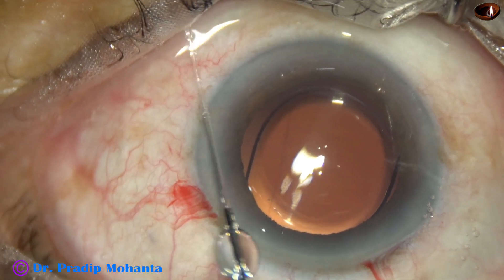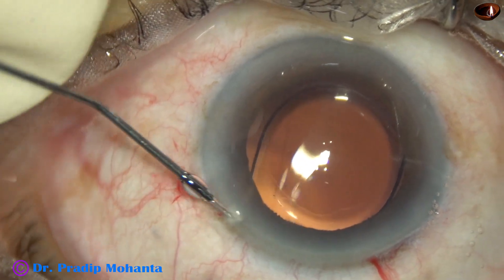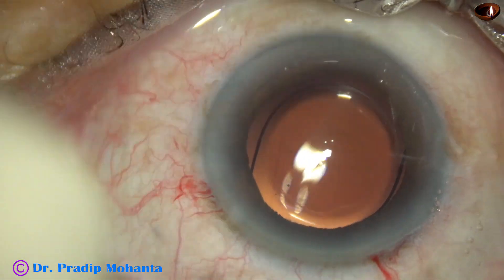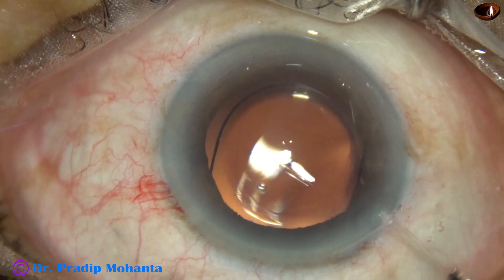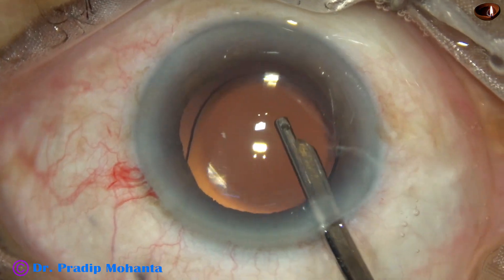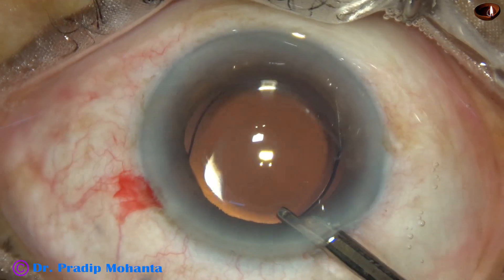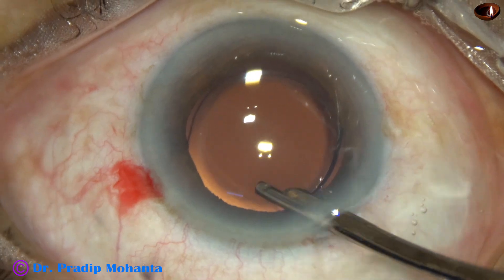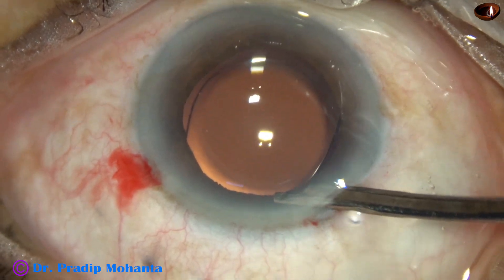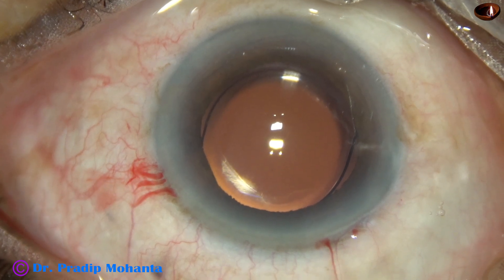The side port is closed by stromal hydration. I always do a final lavage and form the anterior chamber nicely by the Simcoe. Integrity of the wound is checked and the case is concluded.